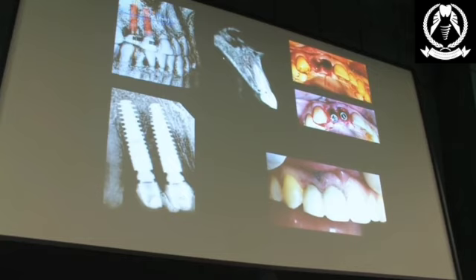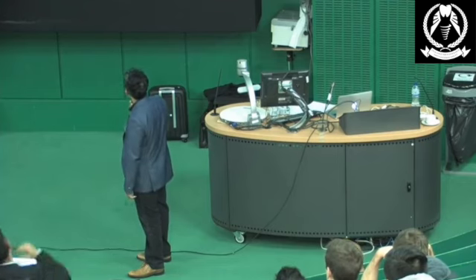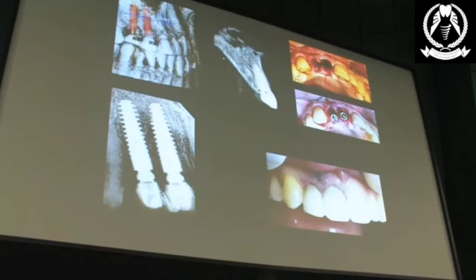Now, aesthetically, to get this right for immediate placement, that's where your implant head should be, and it should be 1 millimeter behind the line from the cervical margins of these adjacent teeth. If you get it too far forward, you end up with a long tooth. Too far back, it might not hit the occlusion right, and things like that. This is a spot-on measurement.